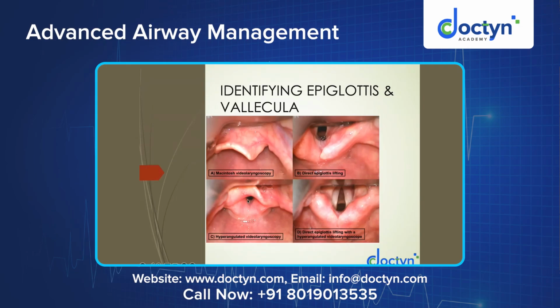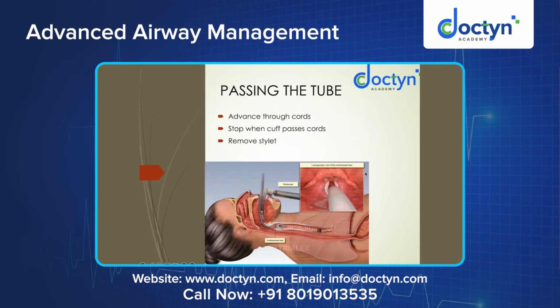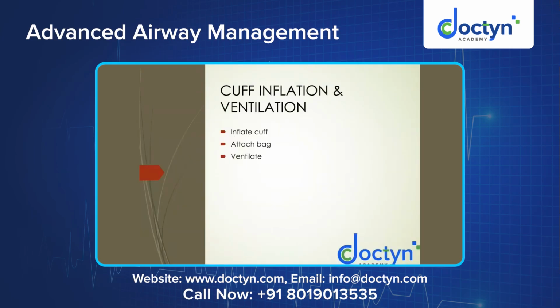And this is the glottic opening through which you have to insert the tube. So to visualize the vocal cords, lift the epiglottis with the laryngoscope blade, and you will be able to see the vocal cords like this, white and shining. This is how the vocal cords are. So advance through the cords. Once the cuff has passed across the vocal cords, you usually stop, remove the stylet, inflate the cuff, connect the circuit and start ventilation.